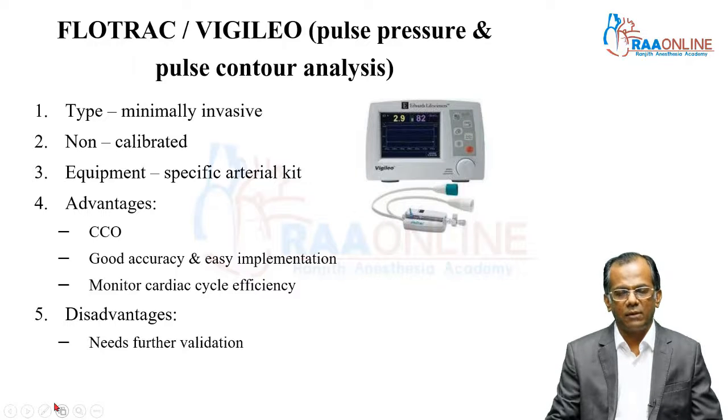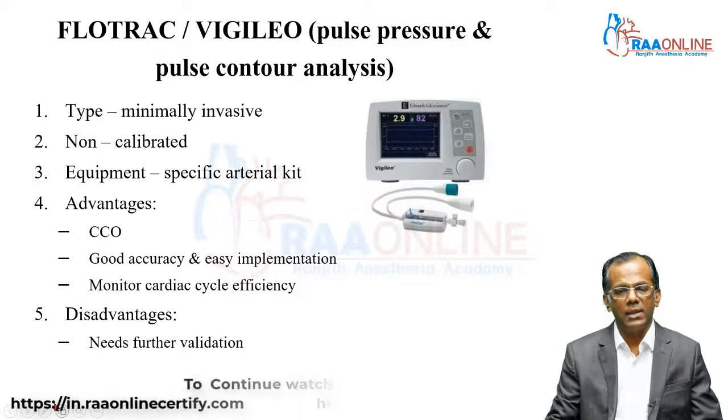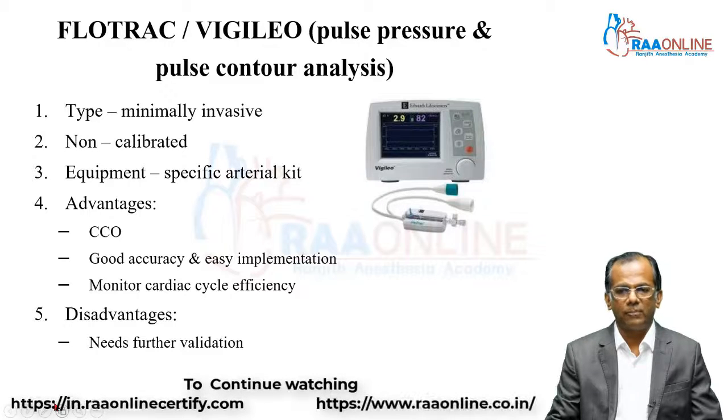The disadvantage of this is this monitor needs further evaluation, especially in conditions where there are arrhythmias, or if you're going to use an intra-aortic balloon pump, these monitors are not validated. So is a patient with severe vasoconstriction where the values may be wrong.